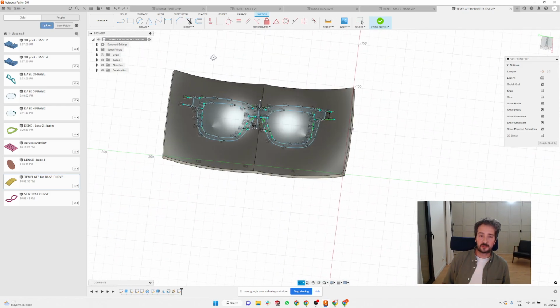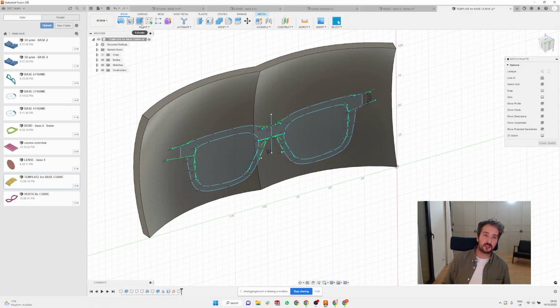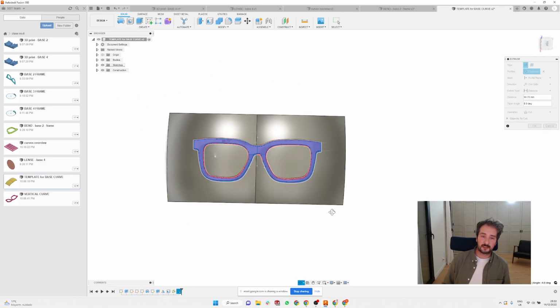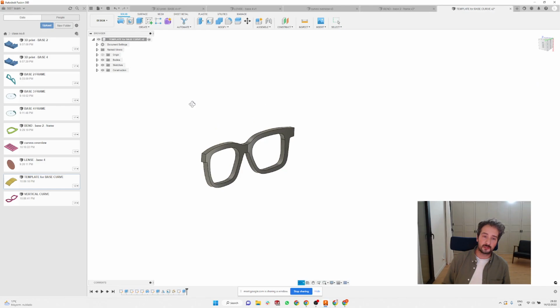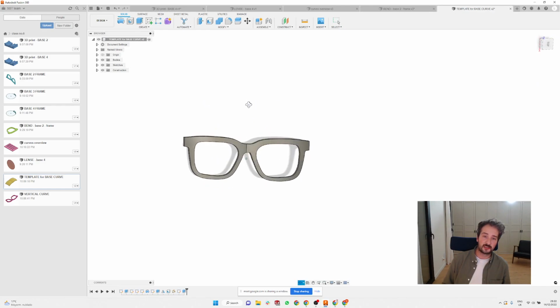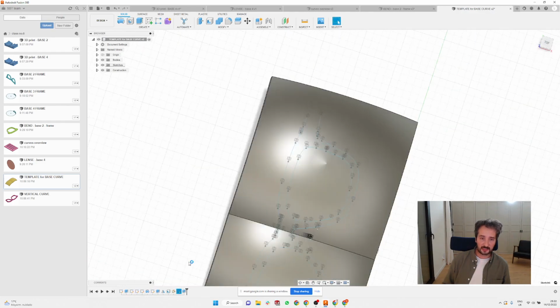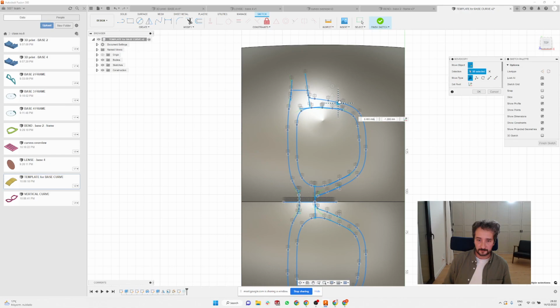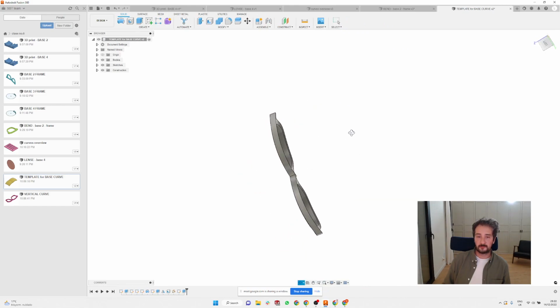And now this is quite nice because you can always have this base, insert your sketch of the frame, and all you need to do is, in a solid, click on extrude, select your frame, and pull it against that template of the lenses. You're not gonna cut, but you're gonna use the function intersect, and that's gonna give you the frame with a base curve, with a cylindric curve on the lenses and a curve overall. This looks a bit weird because I don't have it in the center, but I can select it all and move it a little bit towards the center. And you have the frame in a base curve.